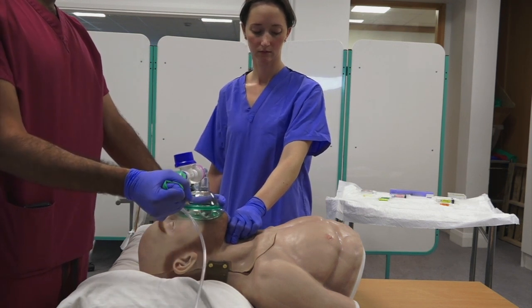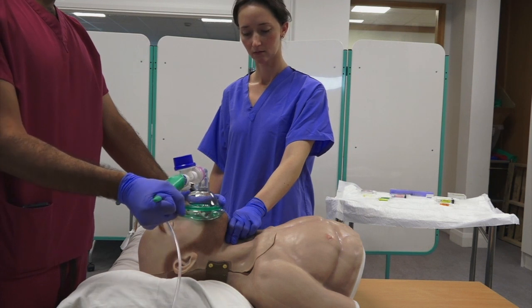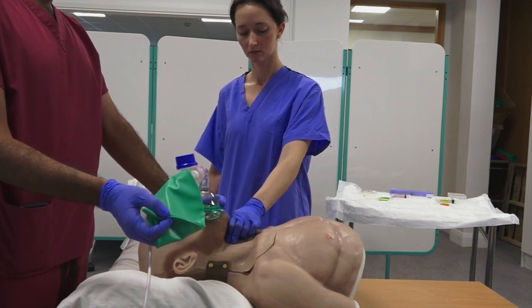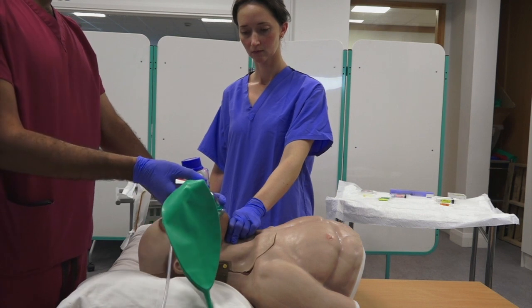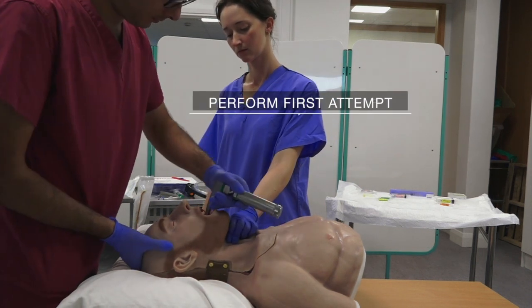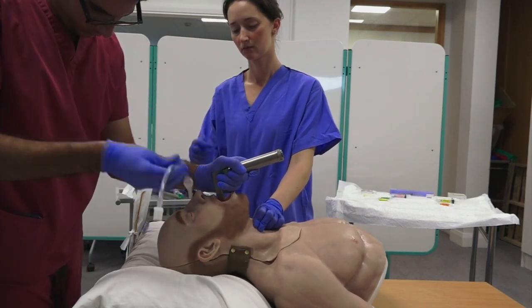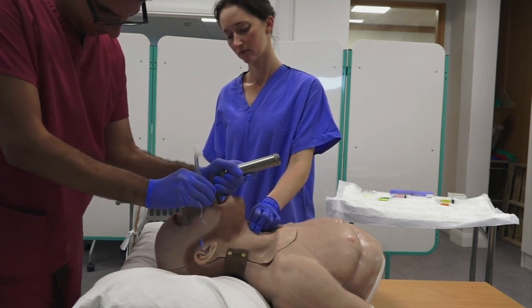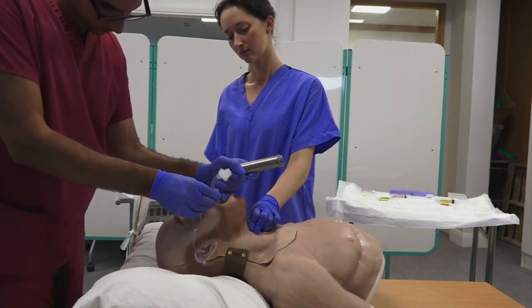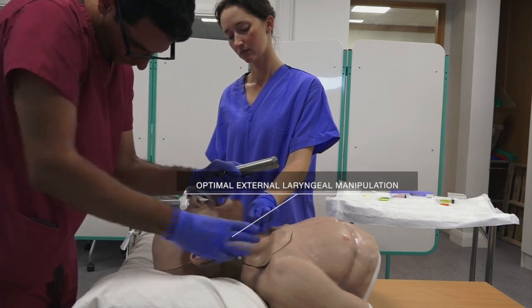Optionally bag mask ventilate the patient if respiratory function is poor. The decreased risk of hypoxia must be balanced against the increased risk of aspiration for each individual patient. Once the patient is paralyzed, perform the first attempt at intubation. Here a direct laryngoscope is used, but a video laryngoscope may be electively chosen. Open the mouth, extend the neck, insert the laryngoscope into the oral cavity with the left hand, track the tip along the base of the tongue into the vallecula, sweep the tongue to the left, lift the laryngoscope to reveal the vocal cords, and attempt to insert the endotracheal tube.